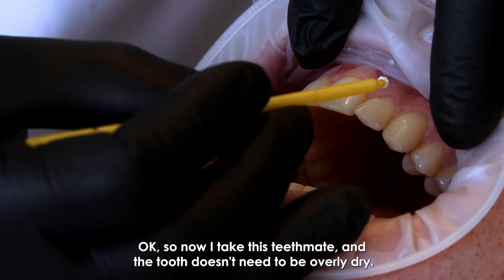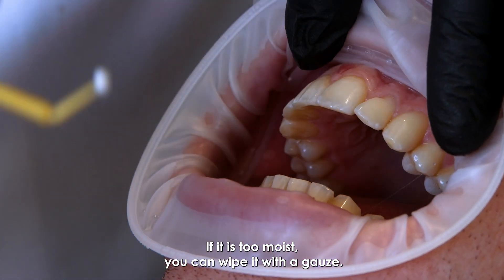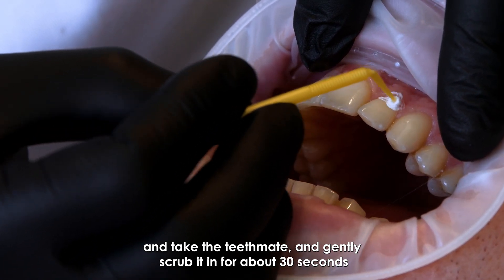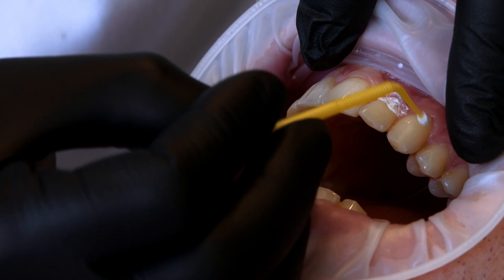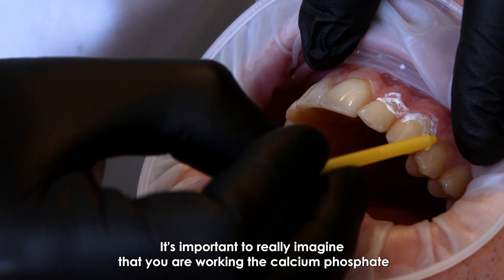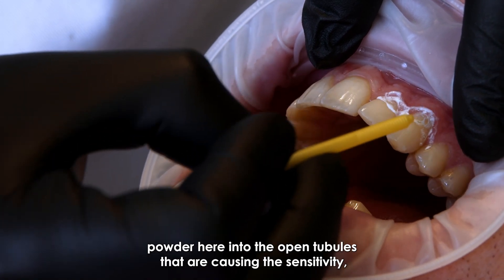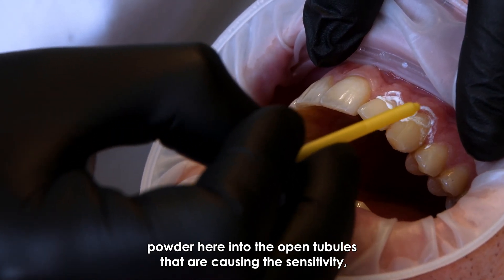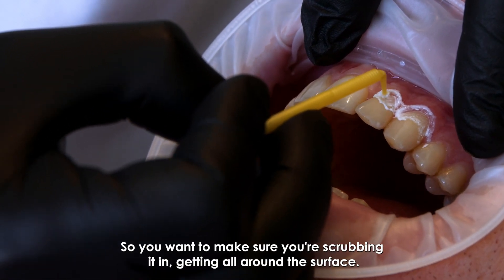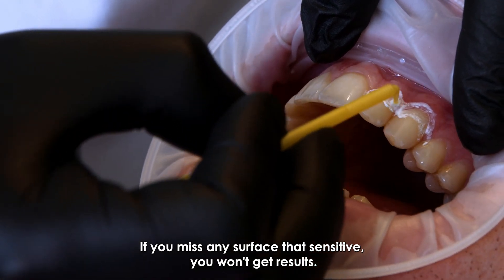Now take the Teeth Mate — the tooth doesn't need to be overly dry. If it's too moist, wipe it with gauze, but as long as there isn't too much saliva, go ahead and gently scrub it in for about 30 seconds to the teeth you are desensitizing. It's important to really imagine you're working the calcium phosphate powder into the open tubules that are causing the sensitivity. It's very common to underdo it, so make sure you're scrubbing it in and getting all around the surface — if you miss any sensitive surface, you won't get results.